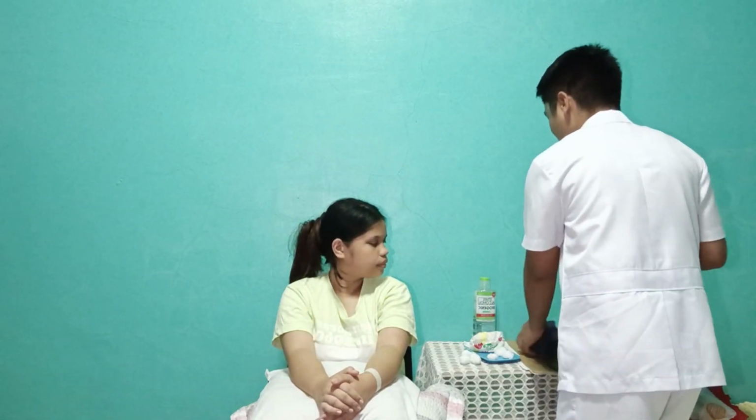So, ma'am, your blood pressure is 120 over 70 millimeters of mercury, ma'am. Next, we need to disinfect the stethoscope to avoid contamination.